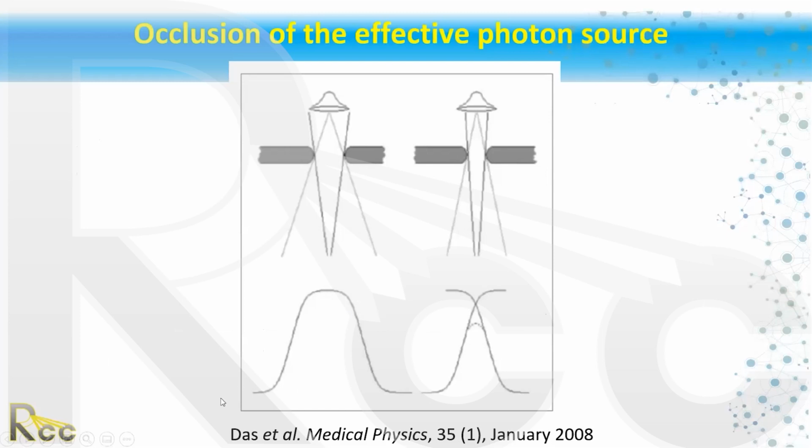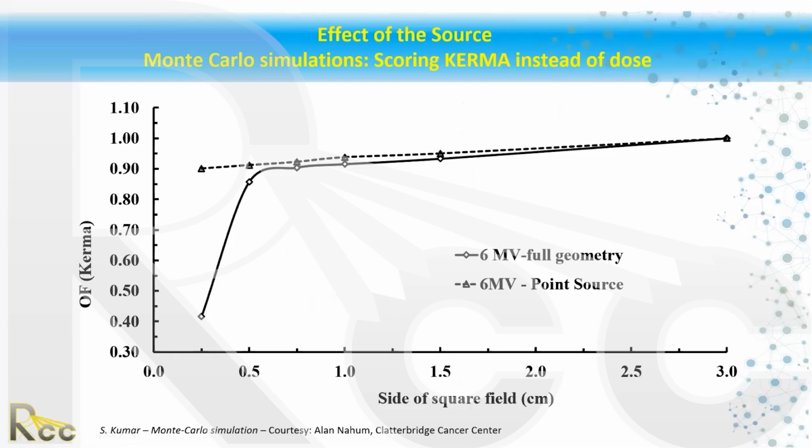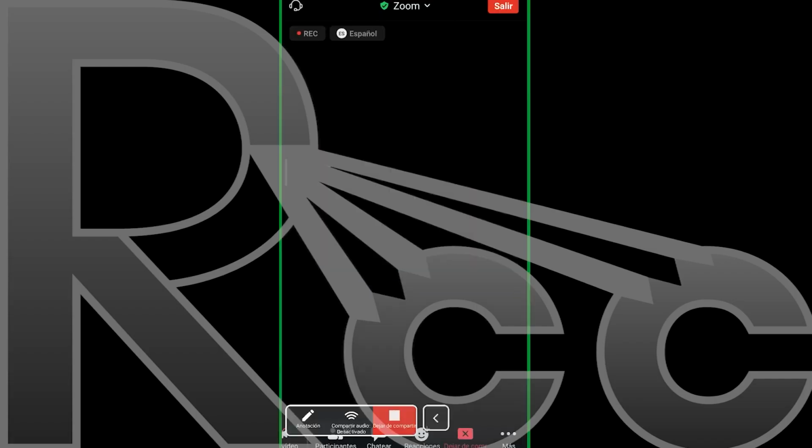So here's a picture from one of these publications. If you look at the location of the phantom and you're looking up, in this particular case, you see that you're encompassing the entire source, right? This is a larger field on the left. On the right, in the small field setting, if you look up from the region of the phantom, you see you're only encompassing some fraction of the source. You're missing the edges of the source. And when you think of the output of the machine as being defined as the sum of fluence over the full source, if you're only seeing part of the source, you're only going to see part of the fluence, right? And as a result, you see this region of lower dose here that is not properly accounted for in planning systems. So when you get very small, you don't account for this eclipsing of the source, which can be quite problematic. So my colleague in the UK did some Monte Carlo simulations.